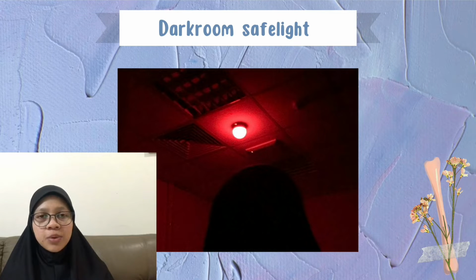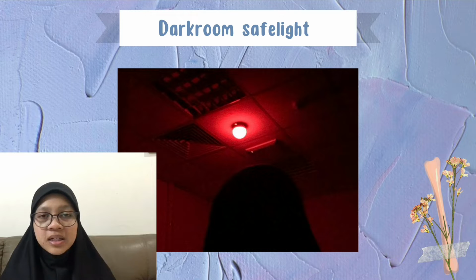The darkroom safe light provides light for working in a darkroom, so the radiographer can see while developing the X-ray film. These lights are designed to provide light in a wavelength that will not expose the X-ray film, because the X-ray film is a light-sensitive material.